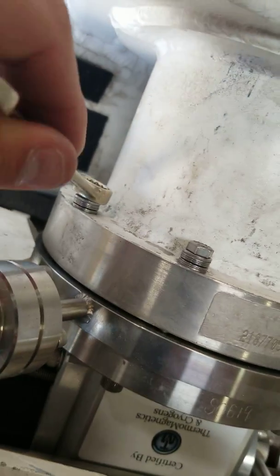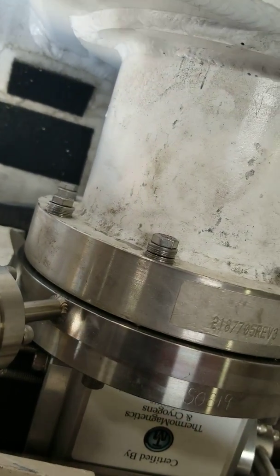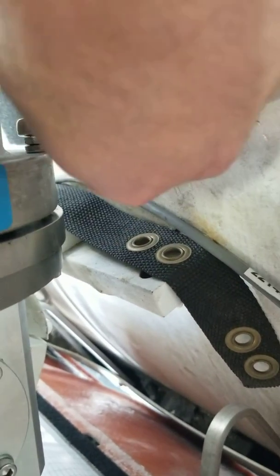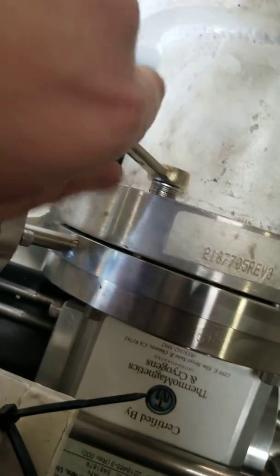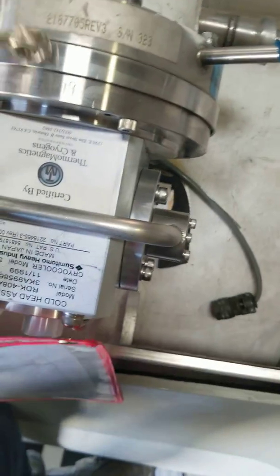Oh, this one here. Last one is down here. Actually missing some washers, which isn't the worst thing in the world. You can still work with it. And then you should finish right next to the one you started with when you're finished. That's it. So you evaluated that the cold head is straight. You tightened the cold head bolts, but you didn't crank on them.